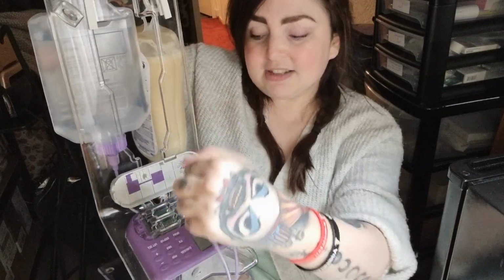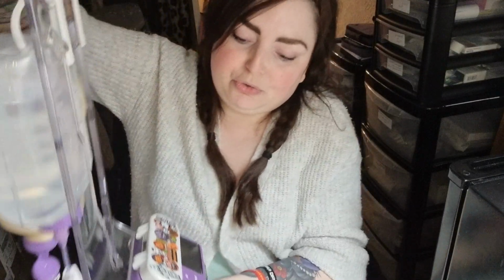Then you get this and you put it round this hoop here. This is a little hoop part, and then you pull it so that it locks into place, but it's really heavy, so I can't show you it happening, but I'll tell you. It's going round the hoop, click, into place, and then that's it in place. The tubing's all in here. You close that because it beeps if you don't. And then, so heavy, that's 2 litres of stuff and a machine and a plastic thing.